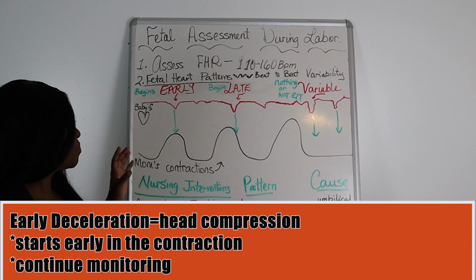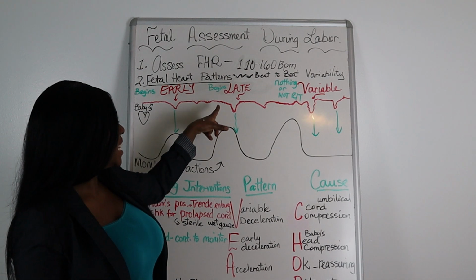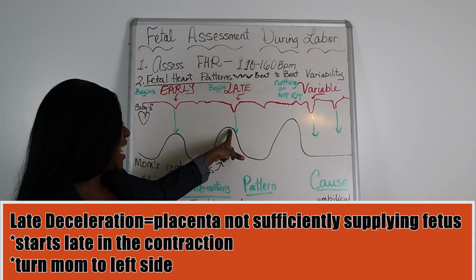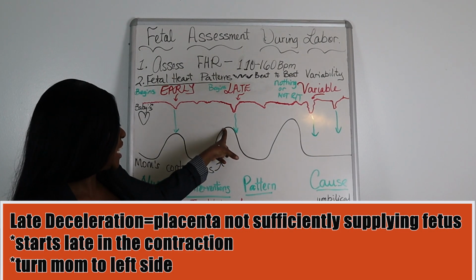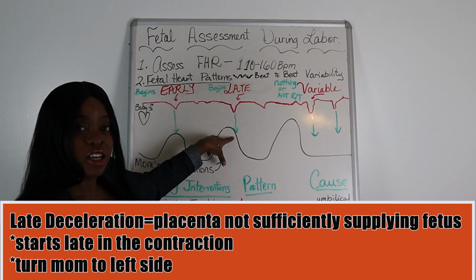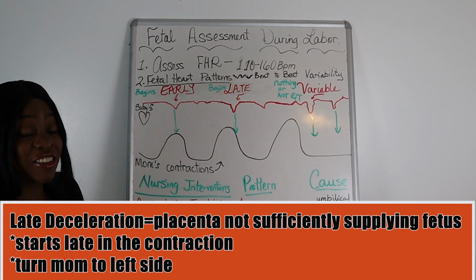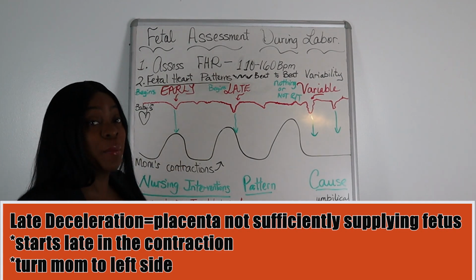that's fine. Another fetal heart rate pattern that we want to look out for is the late deceleration. Remember that the late deceleration in the heart rate pattern begins late in mom's contraction. So if you look here, the contraction has started and even gotten to acme, and here we then have the deceleration. So the deceleration is occurring late with mom's contraction. And so whenever there's a late deceleration, this is not reassuring. This is really bad. It's considered an ominous sign.